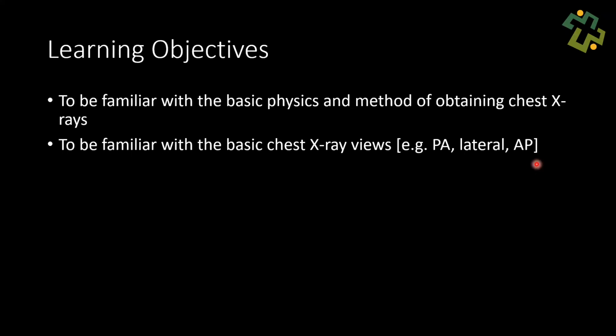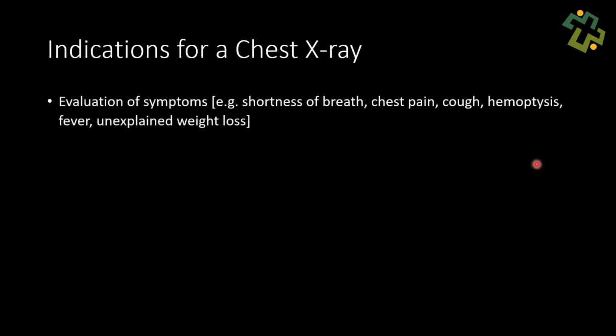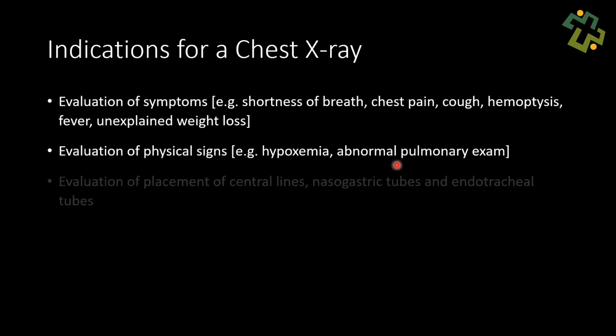Now, along with the ECG, the chest X-ray is one of the most common diagnostic tests in medicine that does not involve drawing blood. Now, there are many indications for a chest X-ray. Why would you probably want to consider doing a chest X-ray? Well, let's look at the indications. First up, evaluation of symptoms. Your patient comes in with shortness of breath, chest pain, cough, hemoptysis, fever, unexplained weight loss. Okay, or maybe you just want to evaluate some physical signs, like you saw the patient is hypoxemic, they're in type 1 or type 2 respiratory failure, or they have maybe crepitations, bronchial breathing on the examination of the chest.